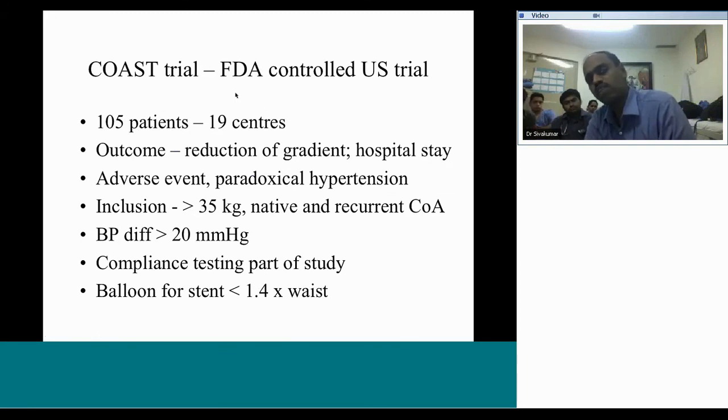All throughout these years, FDA never approved a vascular stent. So if you look at all these stents, they'll be called biliary stents. They'll be called iliac stents. For a major intravascular purpose, FDA never approved a stent because there was no data.